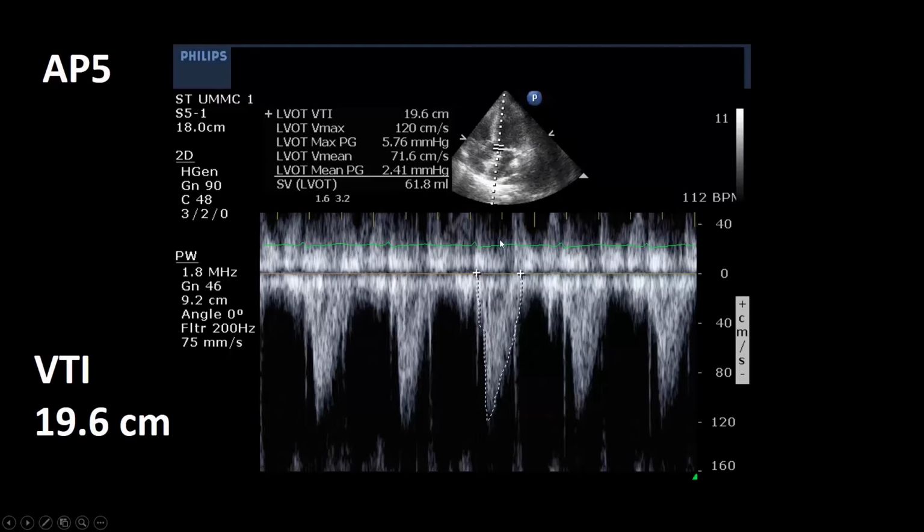There's two different ways to do it. Hina, our sonographer, likes to use the ECG. So systole is going to be the middle of the QRS to the end of the T. I don't always have the ECG hooked up, so I like to use the waveform itself, and you can kind of tell where it's going, and you just drop it down to the baseline here.